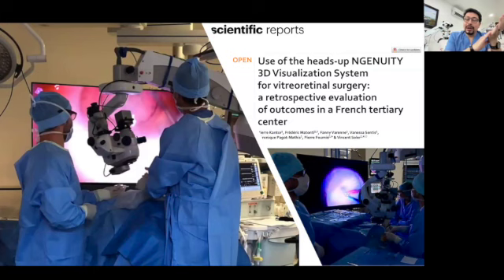But what's the problem? The price is one problem. Maybe a microscope for neurosurgery or for ophthalmology will cost $500,000. And $500,000 is not an investment that a dentist wants to make for having magnification. You can see that those microscopes are huge.